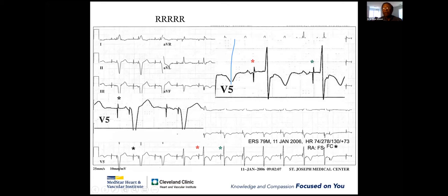This one, one can say, well, it is too close, but this one, there should have been no pacing in the atrium because it should have sensed this. It is a failure of atrial pacing and atrial sensing. Ventricular, I cannot make any comment. Ventricle is capturing this beat. Now, the fourth beat is a pseudo-fusion. And there is another part for our senior physicians here. There are two pacing spikes. And I think one is atrium and one is ventricle.